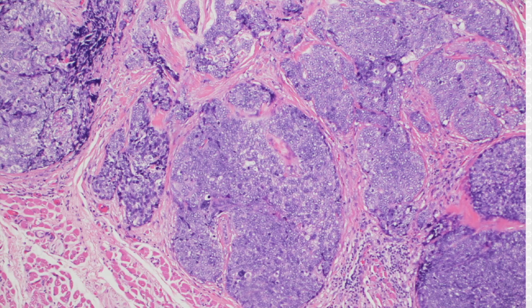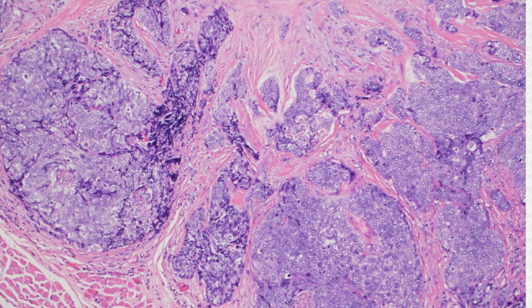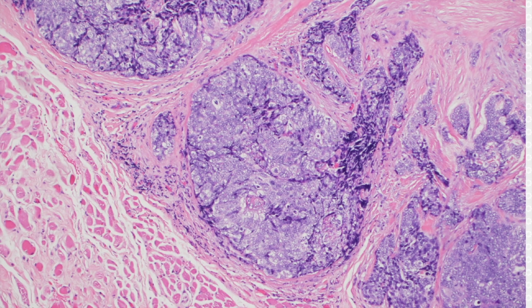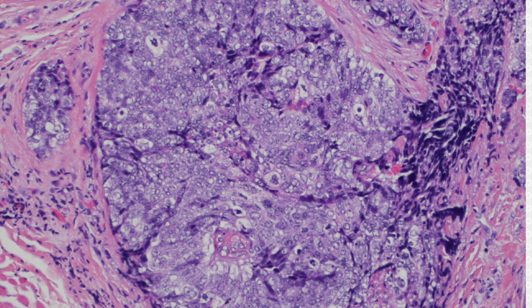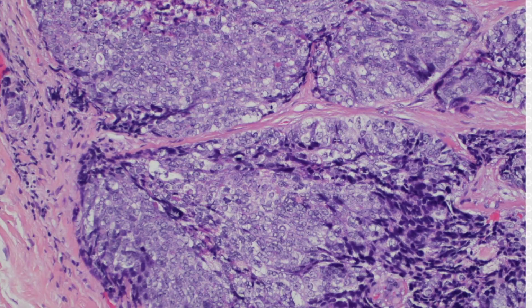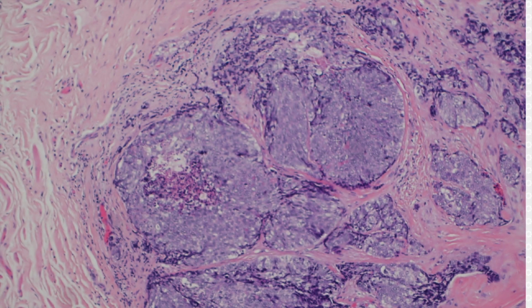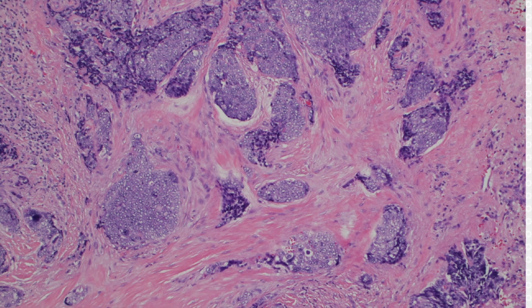But see right here, those are ugly cells, but you would really have trouble telling it's sebaceous. So you can use adipophilin to highlight those vacuoles. We've also found that factor XIIIa, the AC1A1 clone, only that clone works, and it highlights the nuclei of the sebocytes in benign and malignant sebaceous proliferations. EMA will stain them, but it's not specific. It stains other stuff too. The reason there are so many stains is that none of them are totally perfect. Some of those cells there, I would actually even wonder a bit about Merkel cell at first glance.